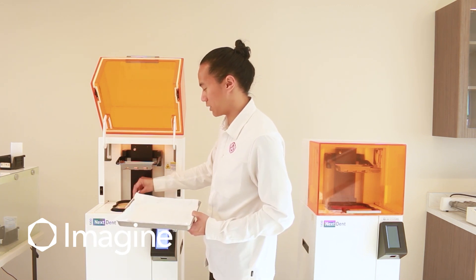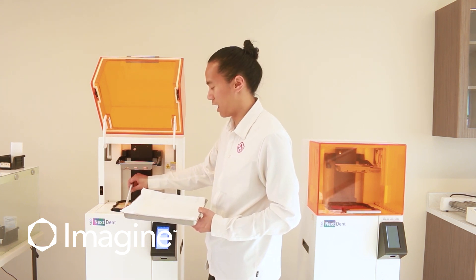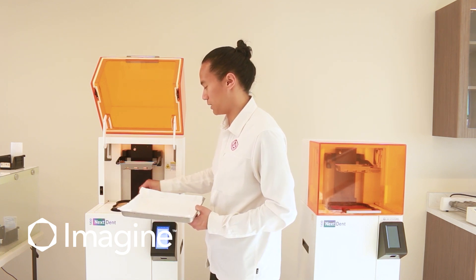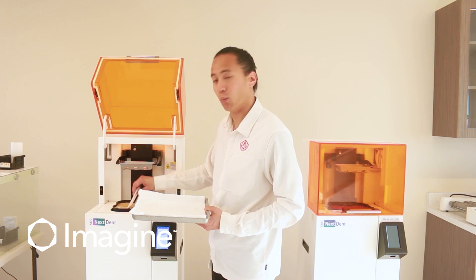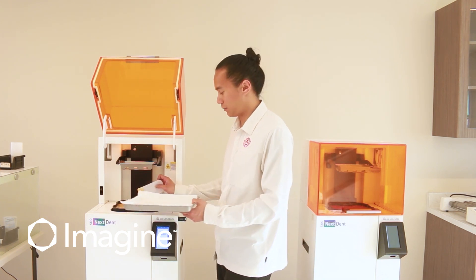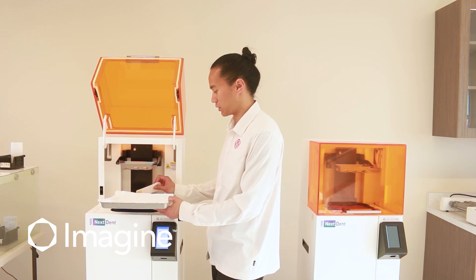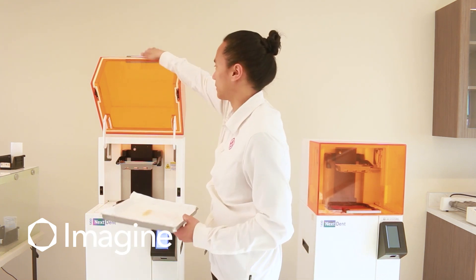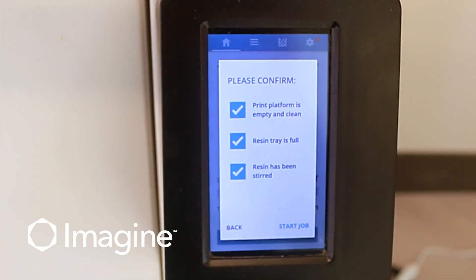At the same time as I'm stirring, I want to make sure that there's no extra debris that might have cured and not attached to the build platform. Typically, if material has already been sitting inside the printer, we're just going to stir this for about one minute. After the material has been stirred, we want to make sure that we catch any excess material from the spatula and put that to the side.